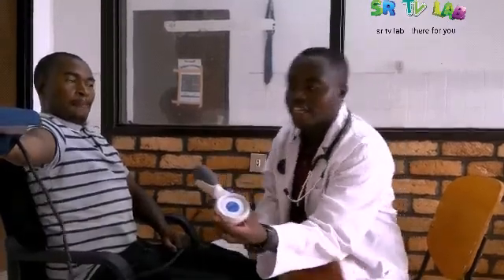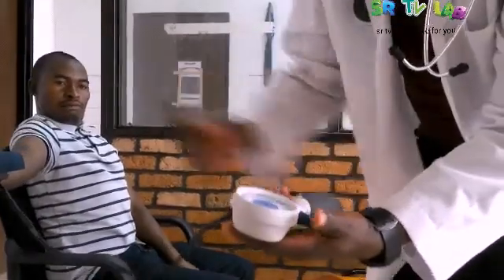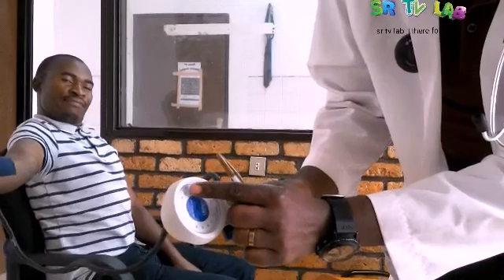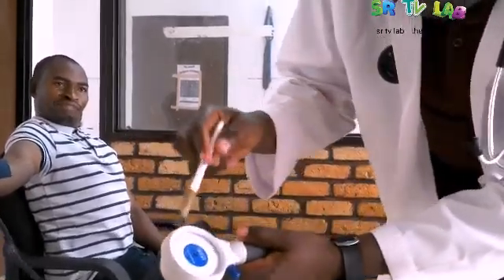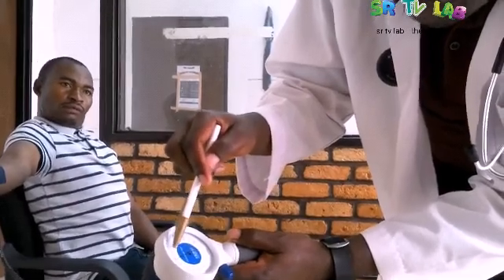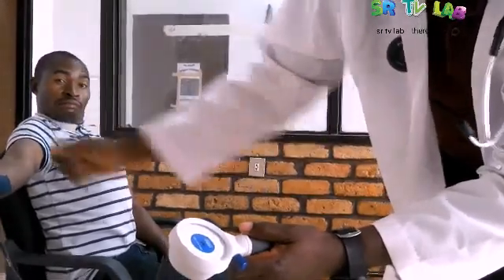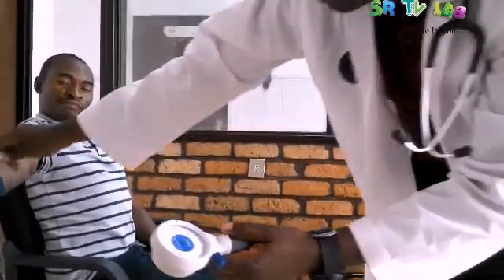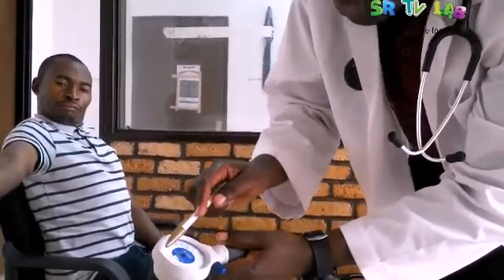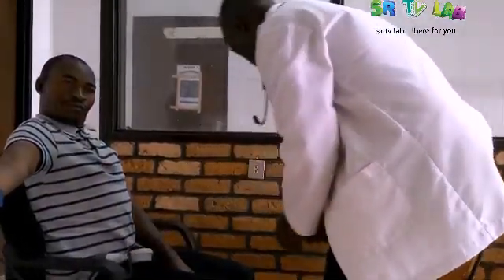Here we are checking if the patient is working — to see clearly if he's working. Please crunch that cuff. If this needle is here at 160, we would like it to be around 160. If it drops, it means he's not working. Please crunch that cuff. This needle has to be at this level. And then we will check the blood pressure.